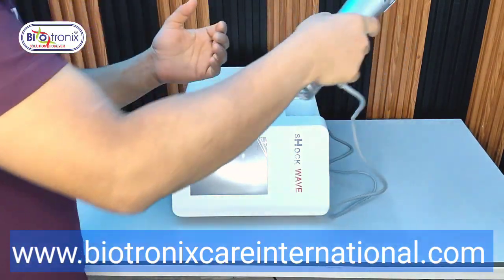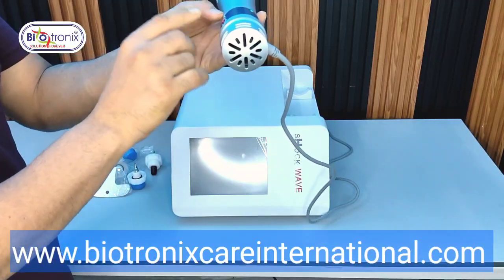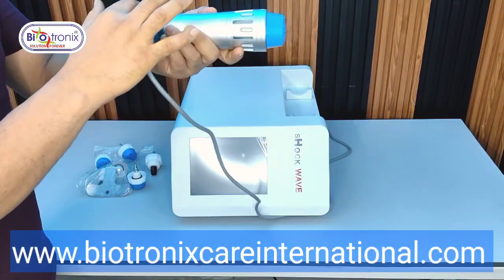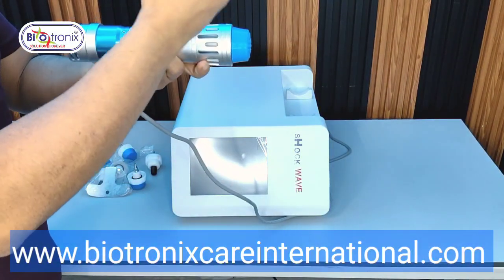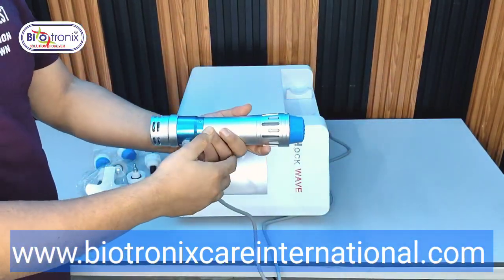This is the probe, you can see. The probe has the bullet inside, a metallic piece. So when the metallic piece travels from one end to the other, it strikes and generates the shock wave. So it travels, strikes and generates the shock wave that we use for therapeutic purposes.